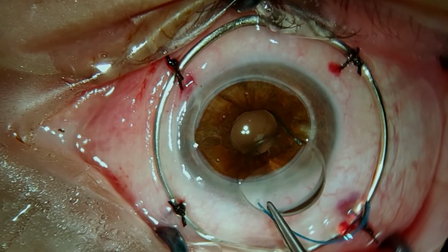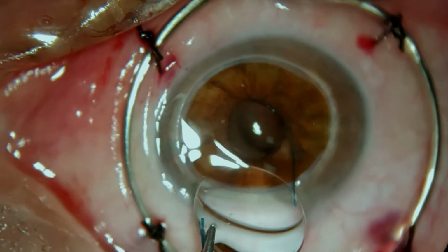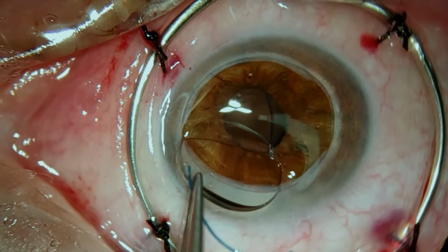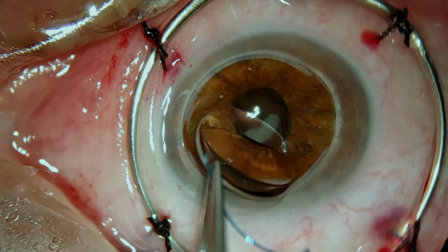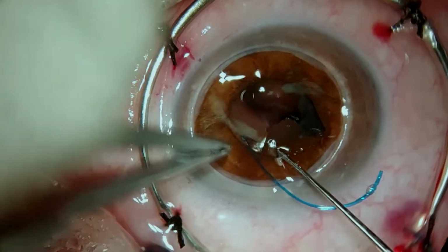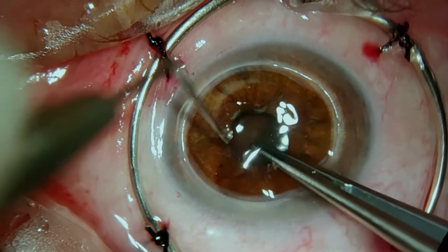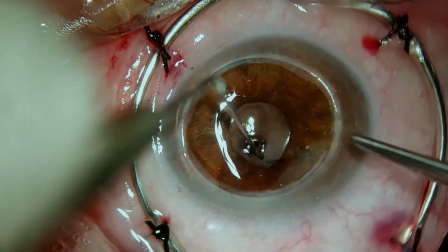Now we see that we've gone into Berger's space with the leading haptic, so we pull out and change the site of implantation and push towards the sulcus. Now we see that the posterior rent is still round, so we know we're in a good plane, and we'll push the trailing haptic into the sulcus.